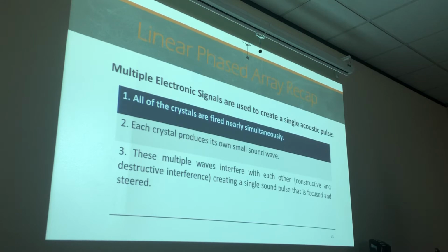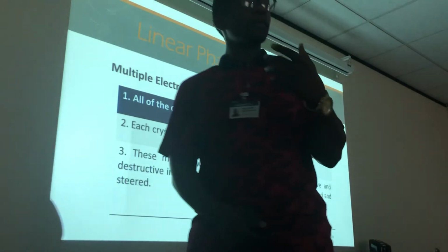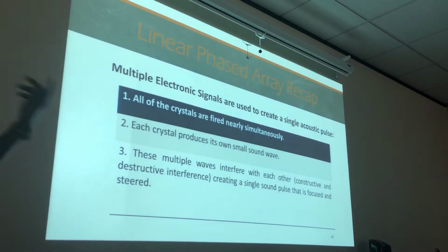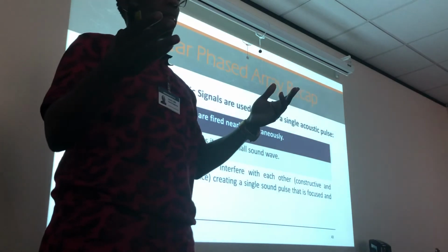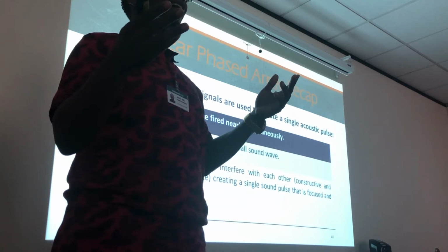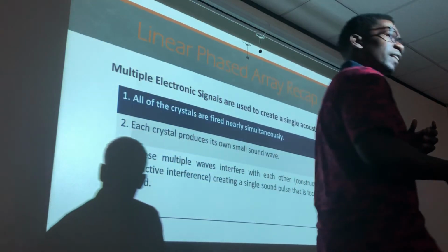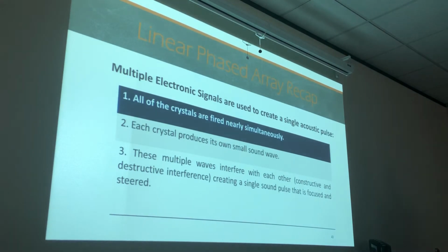What steers the beam? Somebody, one person tell me what makes electronic steering? The slope. Remember those two S's, guys. Steering, slope. If it has a slope, what is actually being sloped though? The electronic signal. The electric spikes being sent to the actual PZT is what's actually being sloped. That's what's going to steer the beam one way, or the other way. Or if it's in a straight line going straight across, it's going straight down, correct?